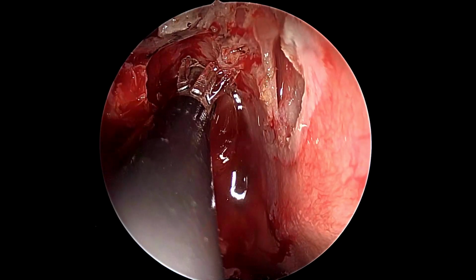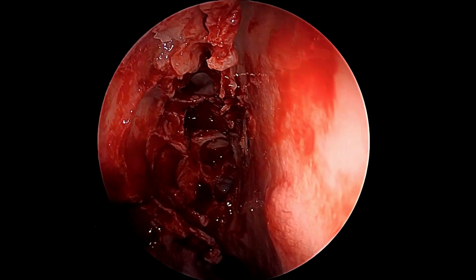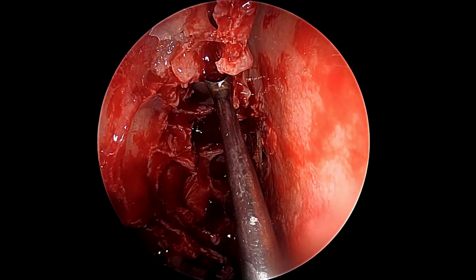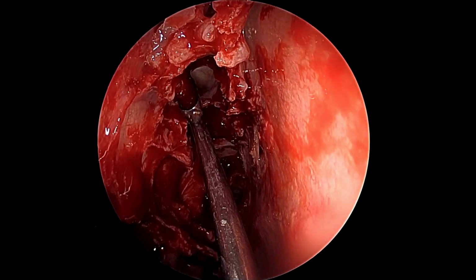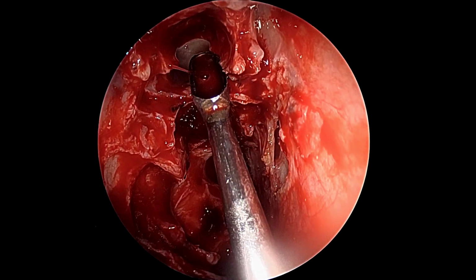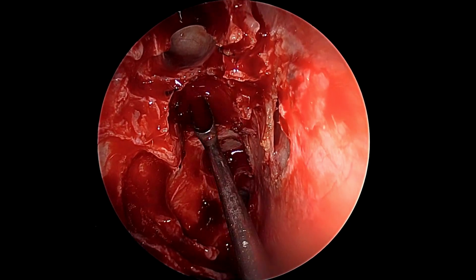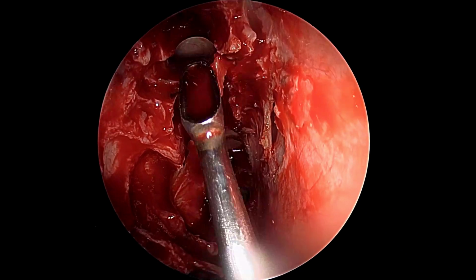Creating a bare bone and removing all possible mucosa around the defect is a fact that cannot be overstated. It defines the success of our surgical procedure. Here we go into the frontal sinus, the frontal recess. Seems to be reasonably widely open. We need to make sure of that so as to not cause any iatrogenic frontal sinusitis because of our reconstruction bulk and volume. And as we see here, the frontal recess is widely open. The ethmoid cavity still has some septations which might need to be taken down.